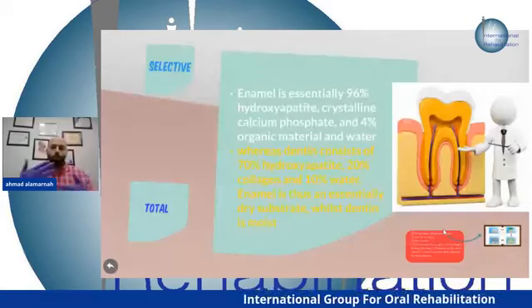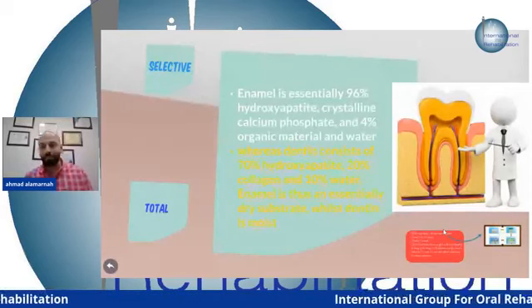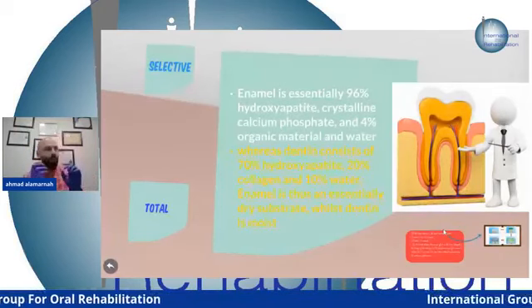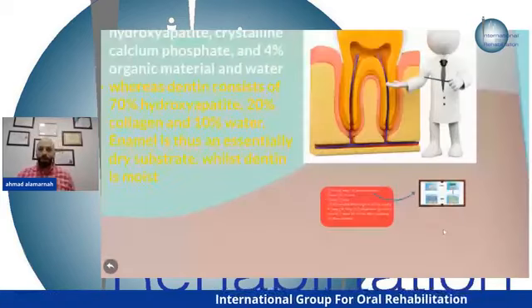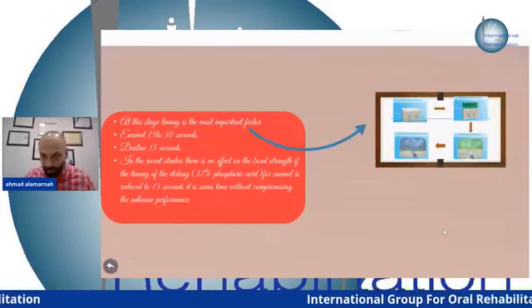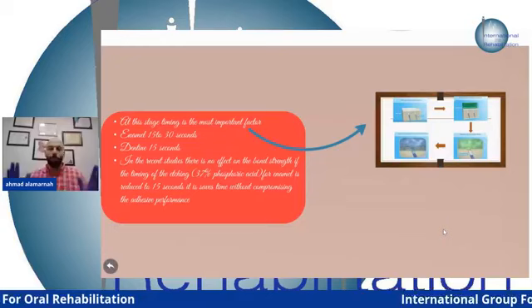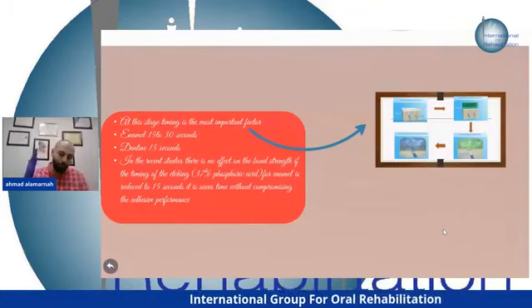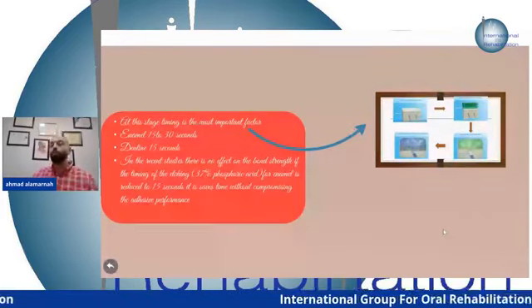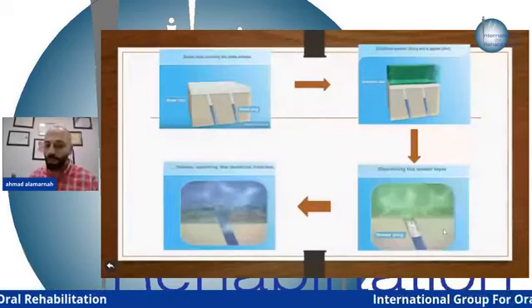So when you do the acid etching, you have to deal with them as separate materials, as separate tooth structures. The enamel is something, and the dentine is something else. Okay. At this stage, the timing is the most important thing. As we said, it's a different material, a different type of tooth structure, the enamel, the dentine. So timing is very important. For the enamel, you can etch it for 15 to 30 seconds, but for the dentine, only 15 seconds and less. Okay, if you etch the dentine more than 15 seconds, what would happen?